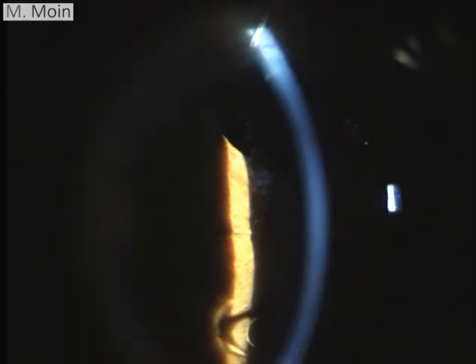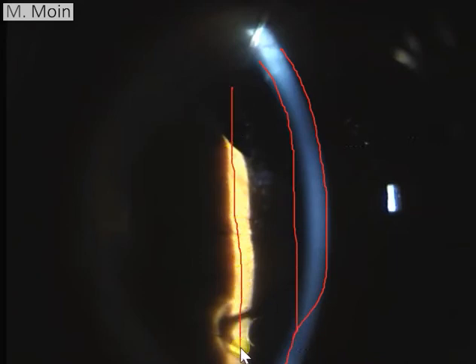The next thing which we want to see is the anterior chamber depth. The main cause of visual loss in anterior chamber IOLs is corneal decompensation. Why? Because you want to see, this is the epithelial slit, this is the endothelial slit, and this is the slit on the iris. This is the AC depth.